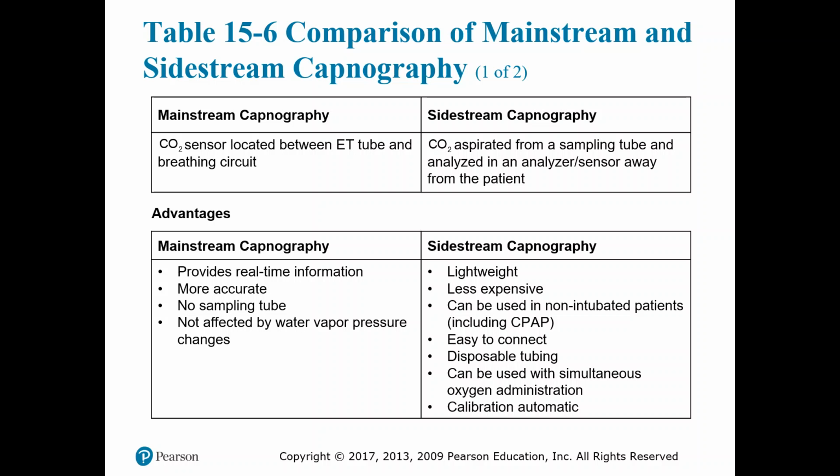They're less expensive. They can be used in non-intubated patients, including with CPAP, by use of either the nasal cannula or the ET tube adapter. It's easy to connect. It's just a simple slip in place and twist into your monitor. The tubing is disposable, it can be used with simultaneous oxygen administration, and the calibration is automatic. So that's quite a few advantages.